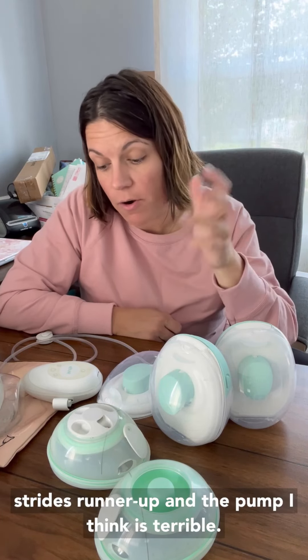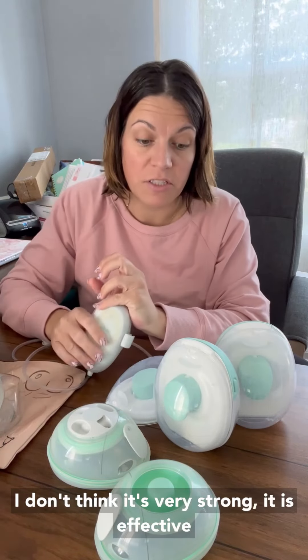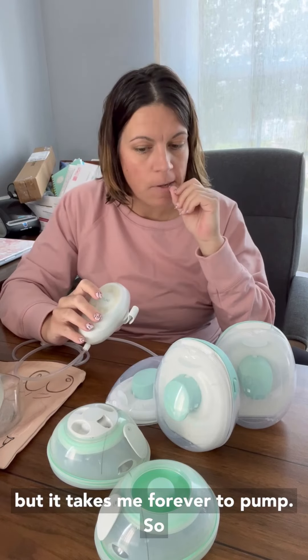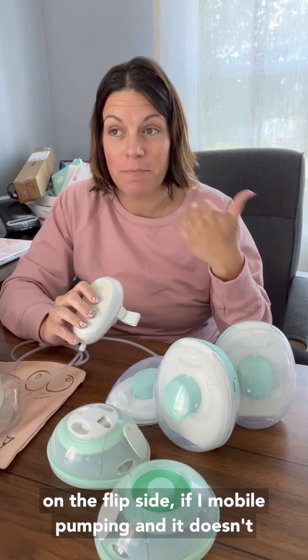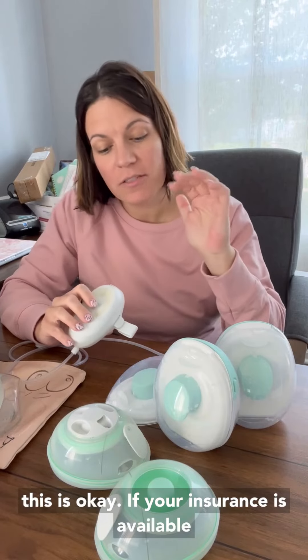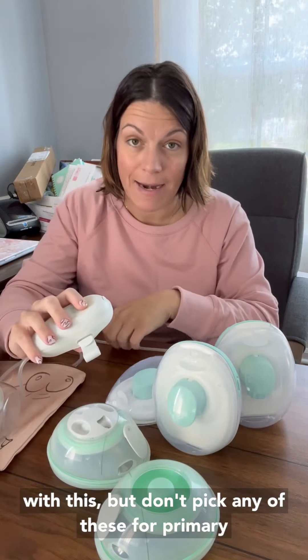The Go wins. Stride is runner-up. And the LV Stride pump — I think it's terrible. It's not very strong. It is effective, but it takes me forever to pump. On the flip side, if I'm mobile pumping and it doesn't bother me that it takes longer, then this is okay. If your insurance is available and you're looking for something mobile, go with this. But don't pick any of these for primary.